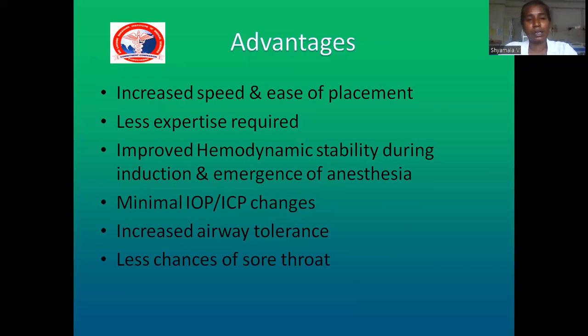It needs less expertise, and the main important thing is it has better hemodynamic stability during the induction and also during the emergence from anesthesia. It has minimal effect on intraocular pressure and intracranial pressure. It increases airway tolerance. It has less chance of sore throat.